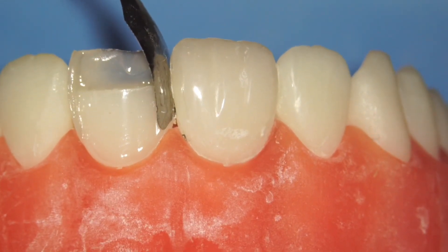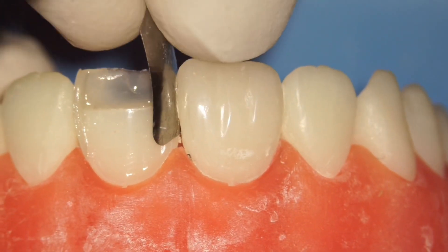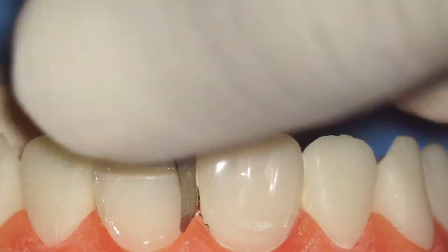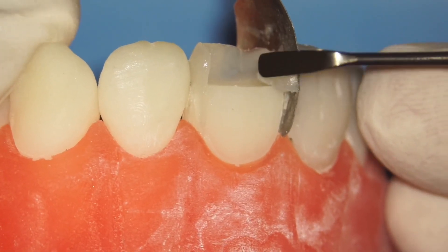An important tip: a lot of people place their matrix without pushing it fully in — that is wrong. You must always push the matrix as deep as it goes; it must be seated into the gums.